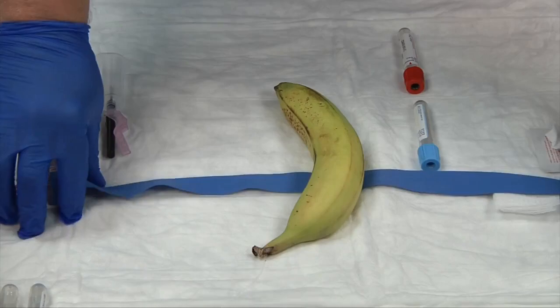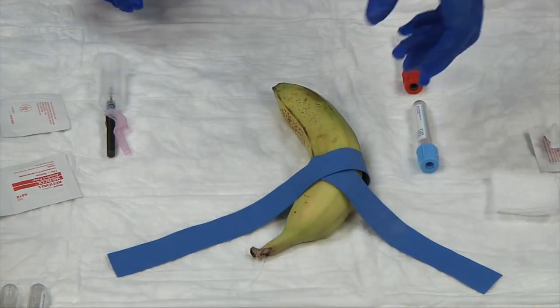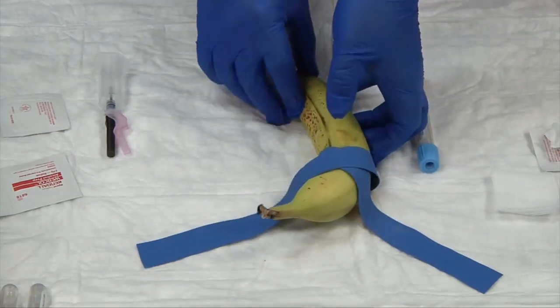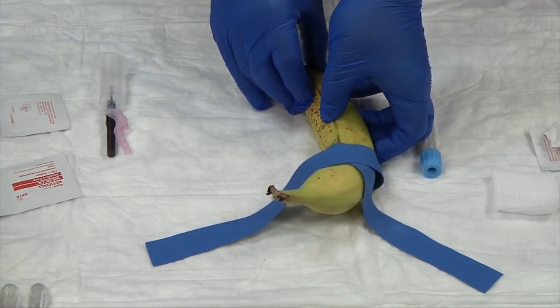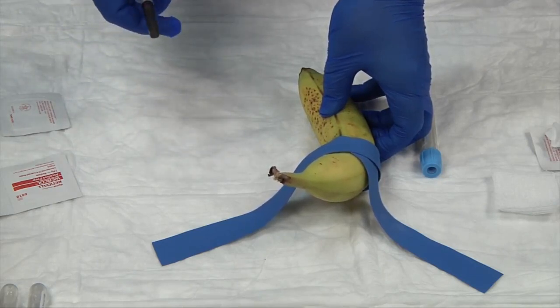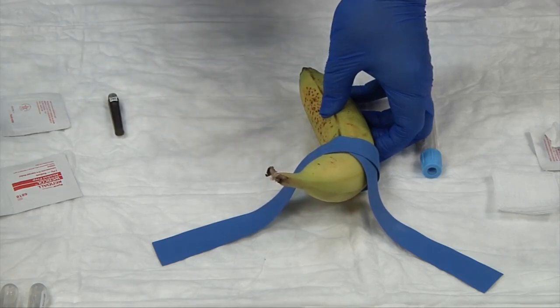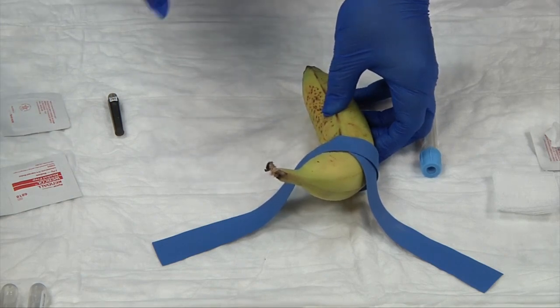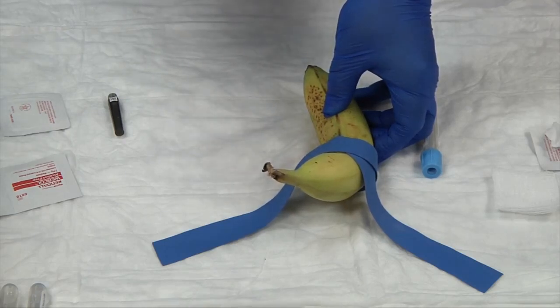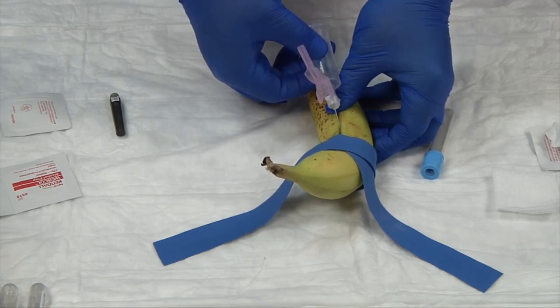The alcohol is already dry on our patient. Let's place the tourniquet back on. With my non-dominant hand, I anchor the vein by pressing my thumb down and back gently to pull the skin tight. With my dominant hand, I take the needle, release the cap, and check for any barbs or shards — anything out of the ordinary. I hold the needle with my safety cap pulled back, my thumb on top, two index fingers below. One, two, stick.